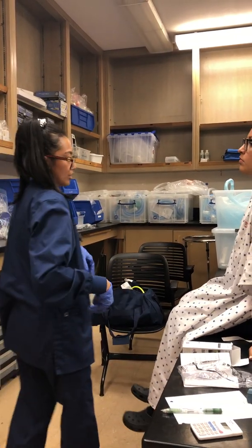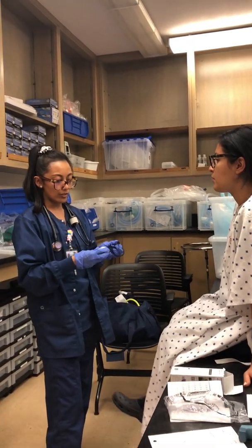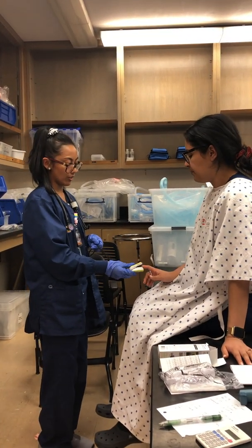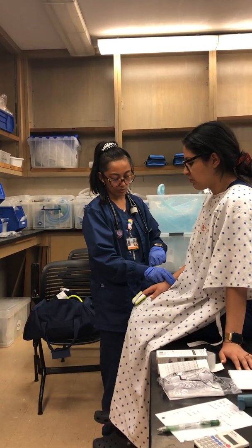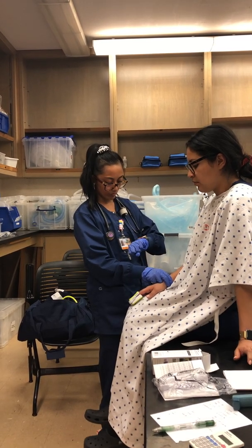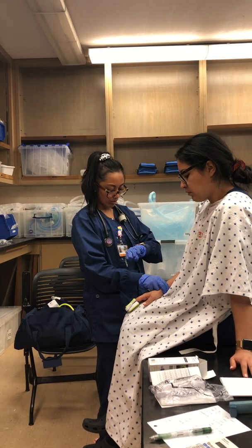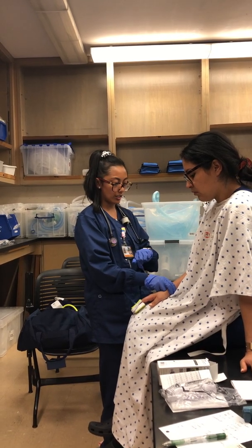How do you feel about your breathing right now? Okay. Better? Do you feel like you have any hard time breathing by any chance? No. No hard time. Okay, so go ahead and place this on your finger. I'm gonna take your pulse again for at least 30 seconds, and then your respiration for another 30. Okay, so for your pulse, I got 45, multiply that by 2, it's 90.